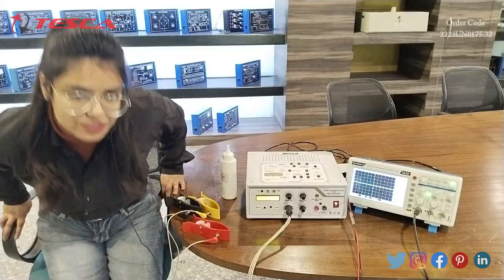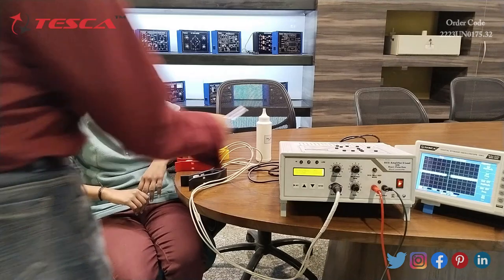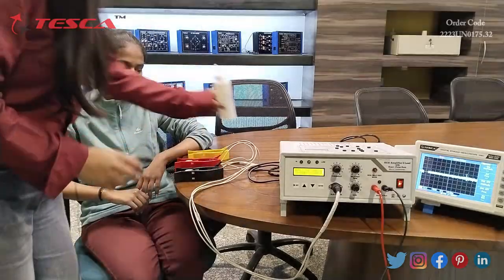Now we will check the BPM of the patient. First of all we apply ECG jelly on the clips — I have already applied it.